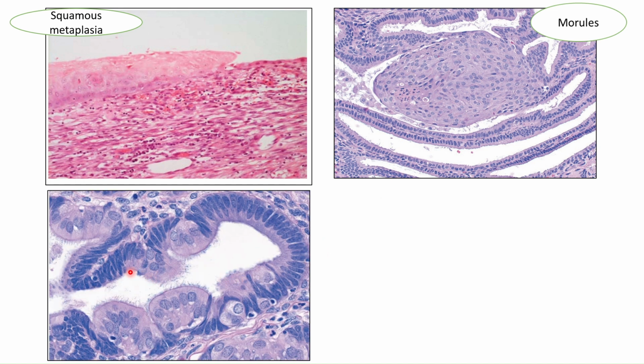Here, this is a beautiful slide. Here we can appreciate an endometrial gland with its normal component along with some abnormal change in the epithelium, where we can find ciliated cells in some part of this gland. So this is ciliated metaplasia or tubal metaplasia.